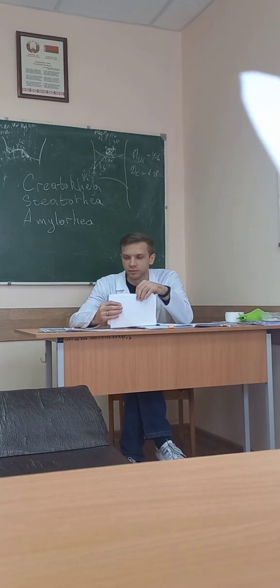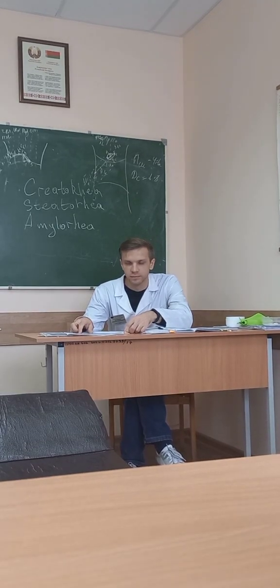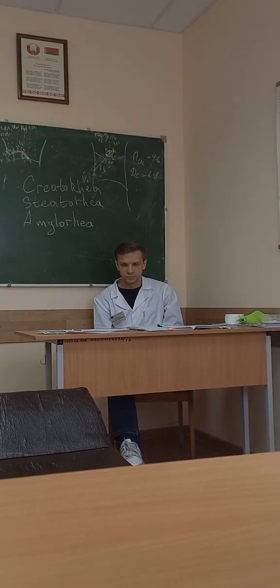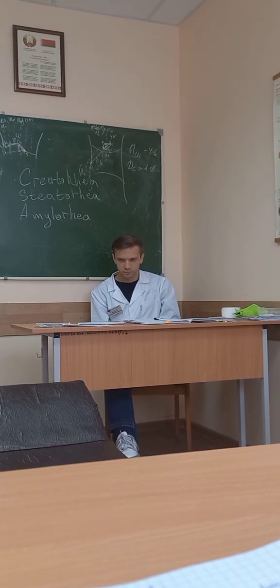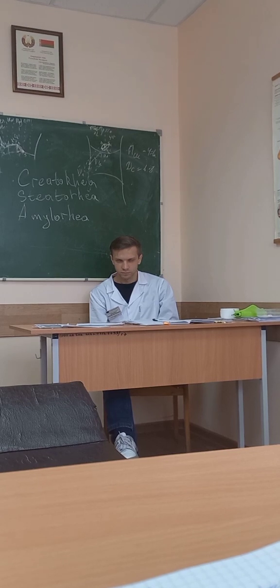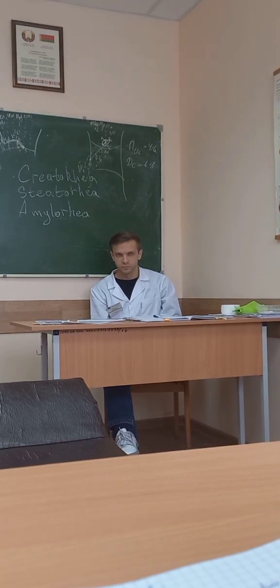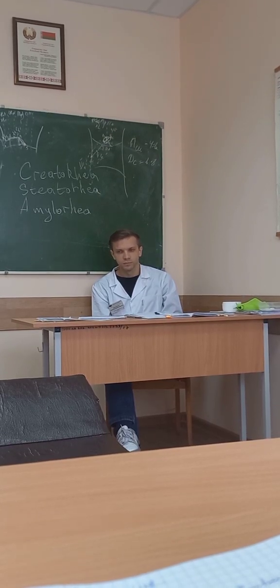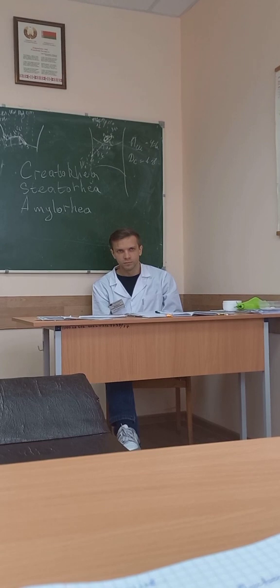Consistency formed, shape cylindrical, color brown, reaction alkaline, smell fecal, hidden blood present, muscular fibers digested 2 to 3 in sight, without striated pattern. Connective tissue absent, fatty acid present, vegetable cellulose digestible absent, indigestible 1 to 2 in sight, starch absent, iodophilic flora absent, erythrocytes present, 4 to 6 in sight, helminth eggs absent.